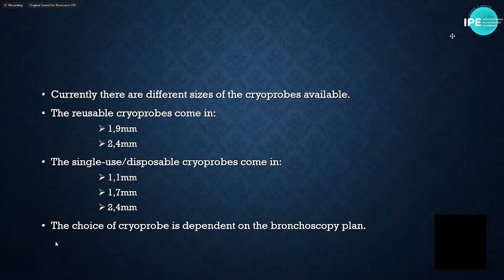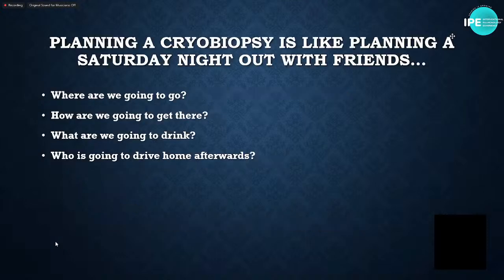The choice of the cryobiopsy that you're going to use is dependent on the bronchoscopy plan that you have. I always get this question, what do you mean about the bronchoscopy plan? I always try to keep it simple, and I say planning a cryobiopsy is like planning a night out with your friends on Saturday. Where are we going to go? How are we going to get there? What are we going to drink? And what's going to happen afterwards? Like, who's driving home? Similarly, that's how you plan the bronchoscopy.